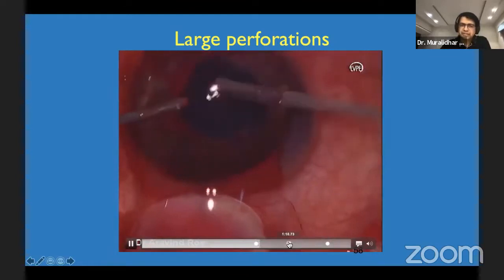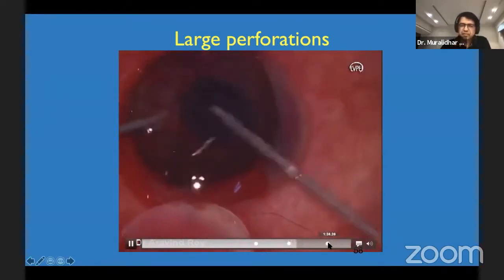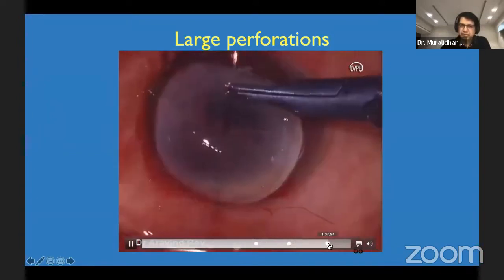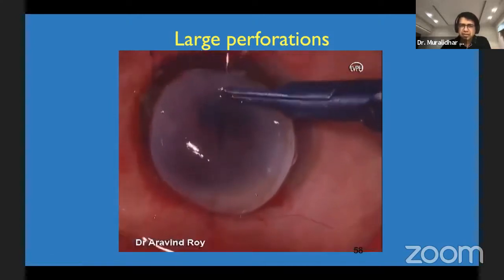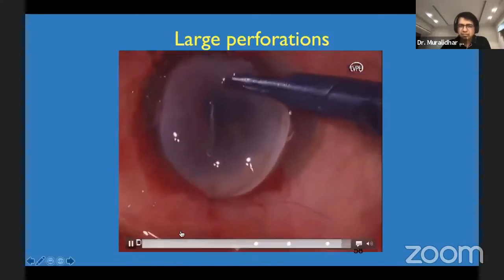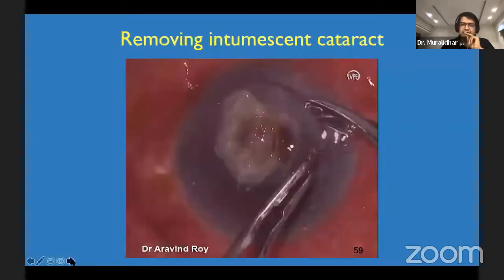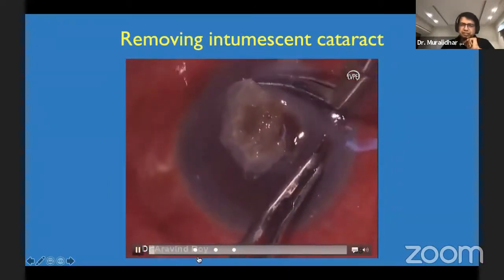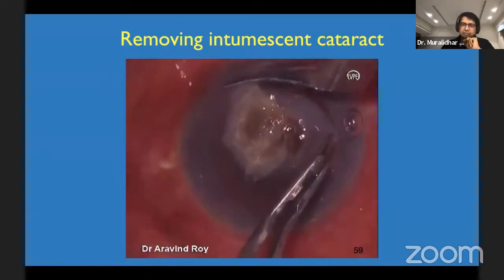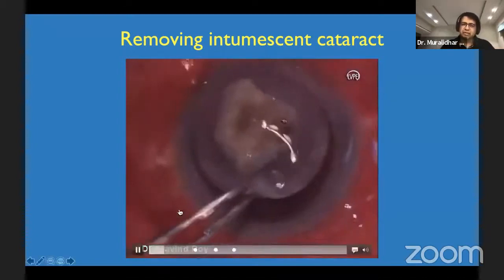So I'm just skipping certain steps. For some unknown reason here, the surgeon ended up removing the lens, although I don't prefer that. This can be eliminated by giving preoperative mannitol and using something other than a wire speculum, which helps you minimize that complication. In cases which have a perforation, I always recommend you seal that perforation with a tissue adhesive intraoperatively, try to reform and simulate as if it is a normal eye.